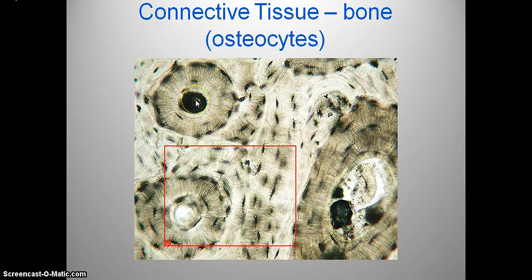The blood vessels are passing through. This is a cross section. Imagine that there is a hose and you cut a very, very small cross section of it. This is what it would be. Plenty of osteocytes or cells in the bone and very spacious matrix taking up a lot of space.